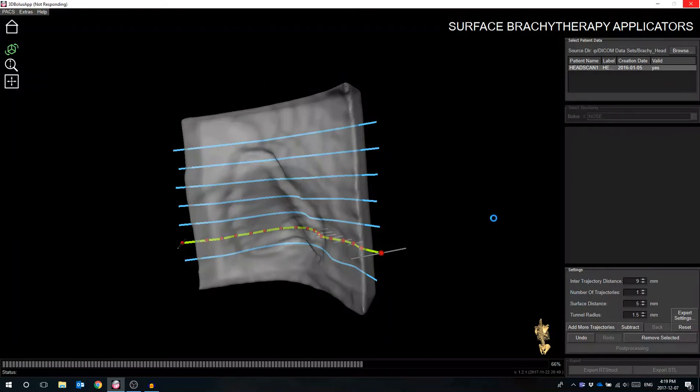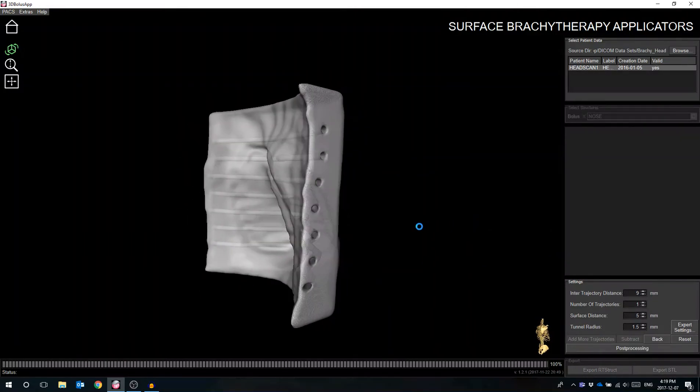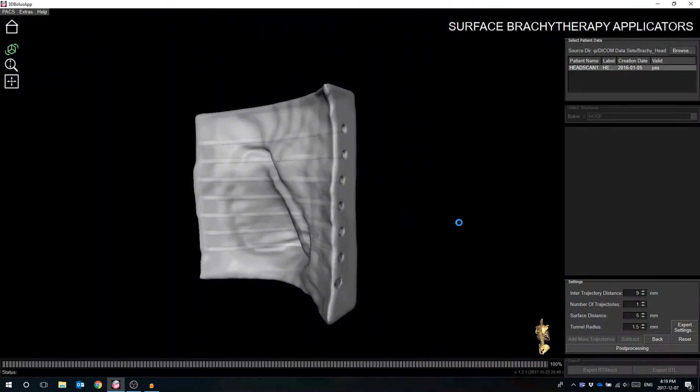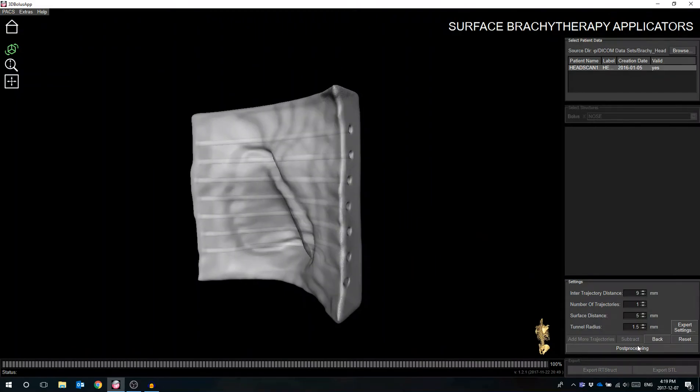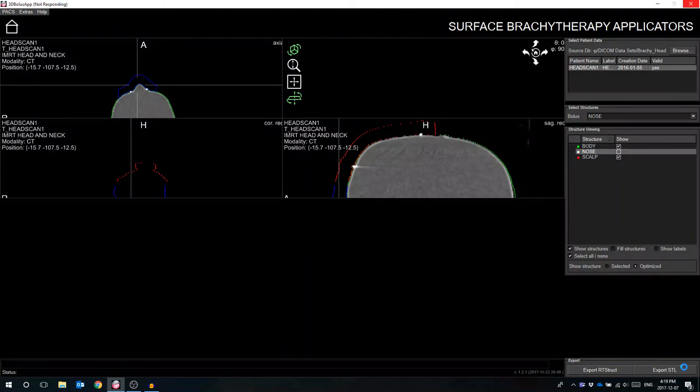Post-processing can include cropping the bottom of the applicator to ensure flat adhesion to the print bed, and also adding the patient ID tag, which will ensure that each printed device is being used for the correct patient. The user can then export the structure as an STL file which is compatible with your 3D printer.